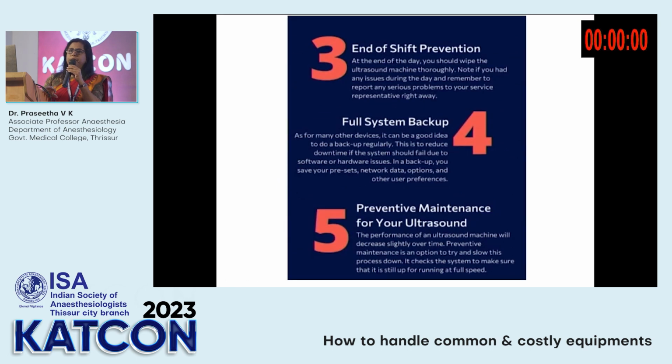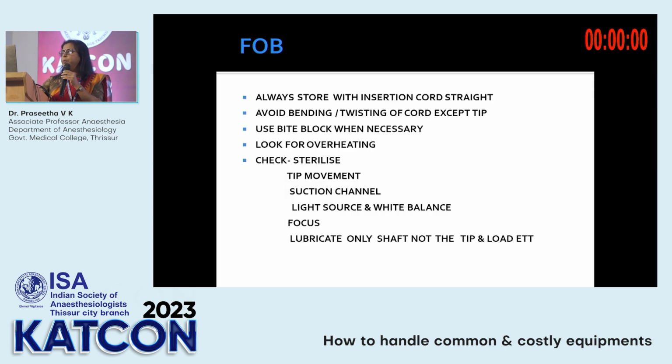And at the end of shift, you have to wipe your machine. You can check whether any damage has occurred during the day, document it and report it. You should also have a backup of the machine regularly. And as a preventive measure, you have to service your ultrasound regularly, and it will increase the life of your equipment.